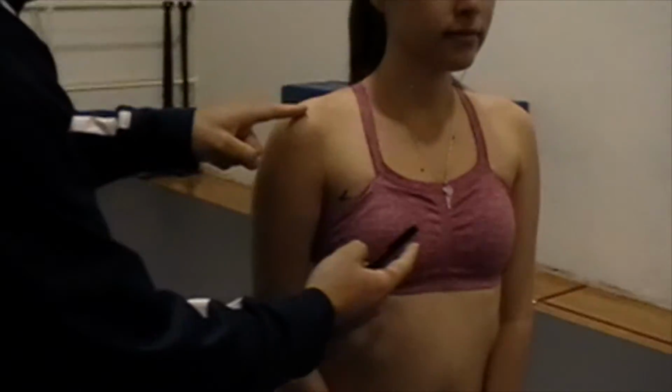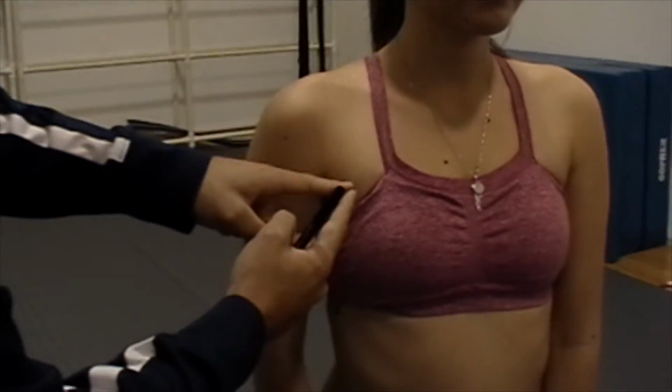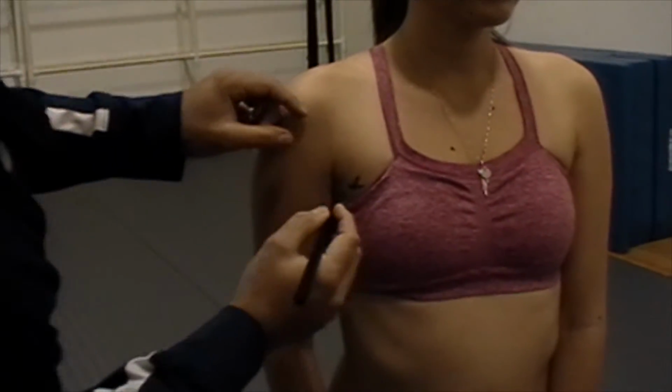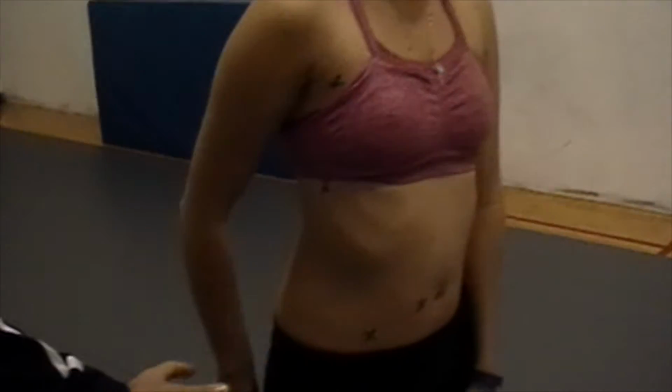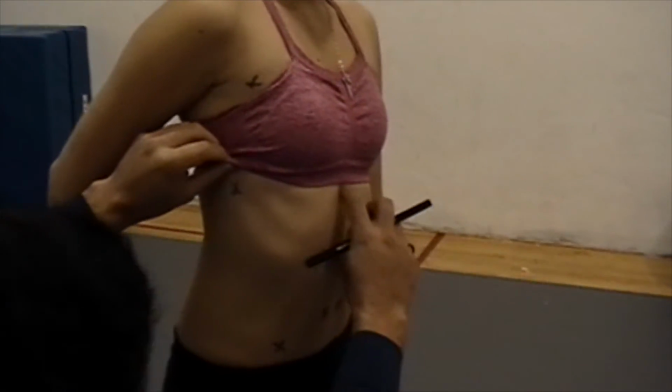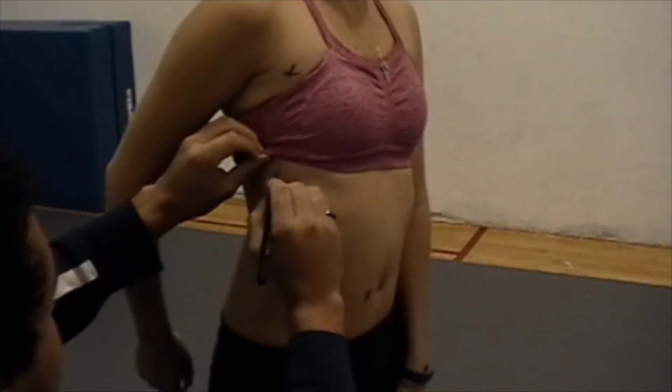Next is the chest or pectoral. It is a diagonal fold with 1/2 distance between the anterior axillary line and the nipple for men, or 1/3 of the distance for women. Next is the mid-axillary. It is a vertical fold on the mid-axillary line at the level of the xiphoid process of the sternum.